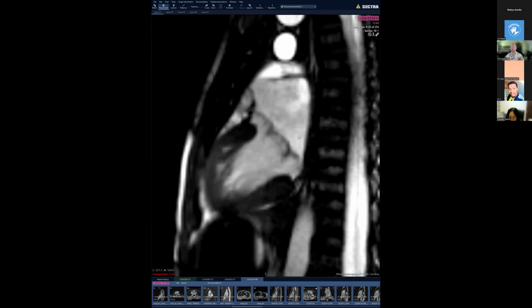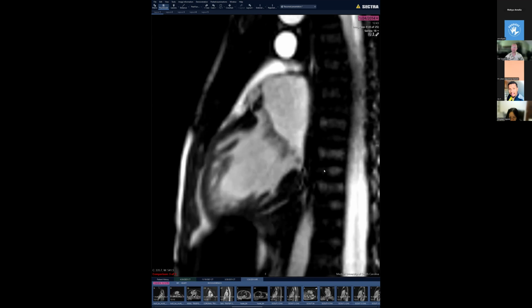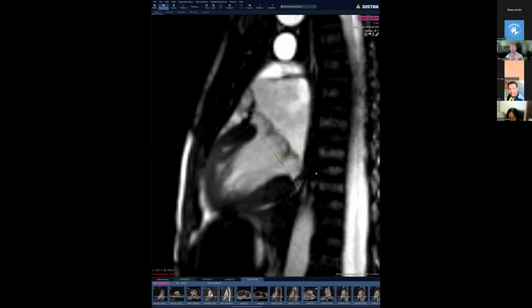Again, if you use your anatomic landmarks at the shoulder of the myocardium here, you measure from that distance the extent of prolapse. Another thing that, while we're at it, we might want to just quickly touch on is mitral annular disjunction. Some of the patients with mitral valve prolapse also have a gap here between the actual myocardium and the actual attachment, the actual fibrous annulus.